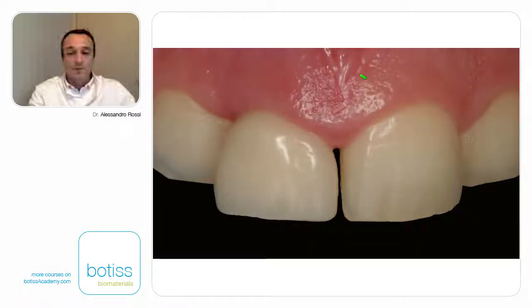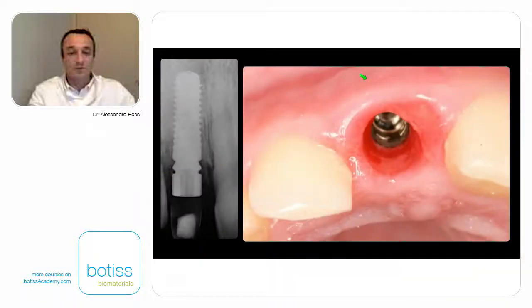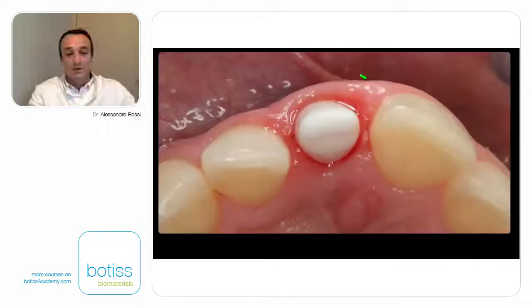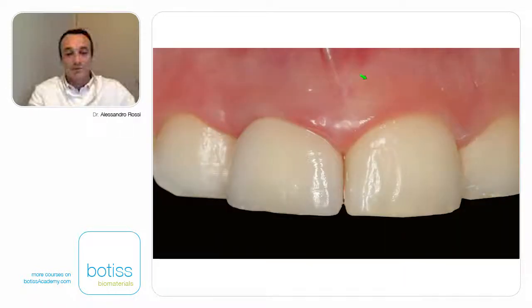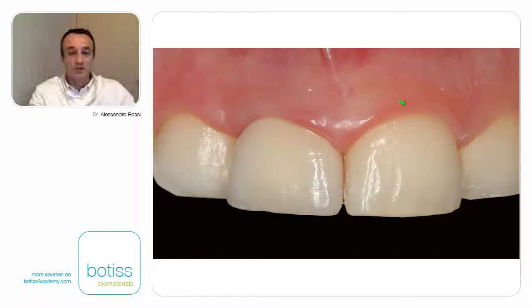Dr. Lopes started the prosthetic phases to give a provisional crown to our patient. Here is what we made. Here is the maturation of the soft tissue after six months, and then the final restoration with this type of result. As you may see, we have a brilliant result with a good position of our soft tissue. When we have stable soft tissue around our crown, we also have hard tissue in the right position.